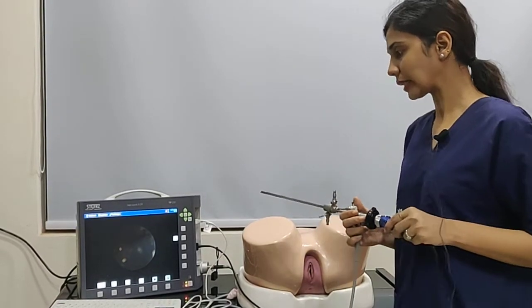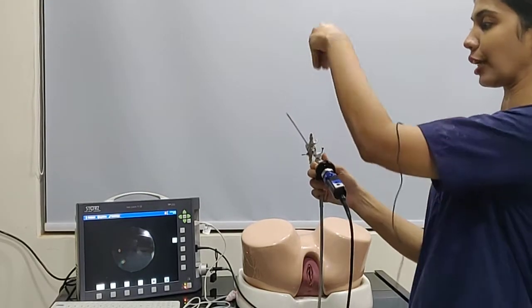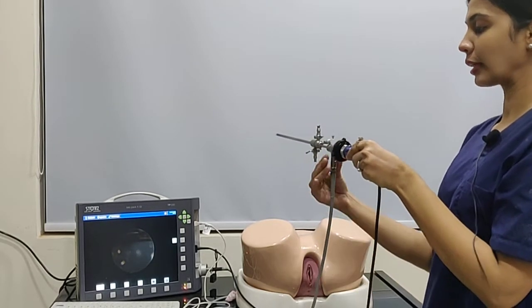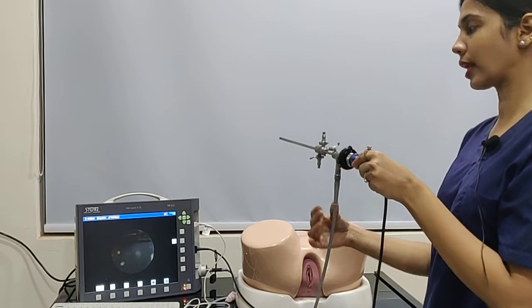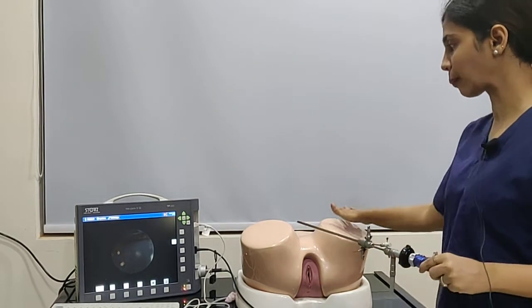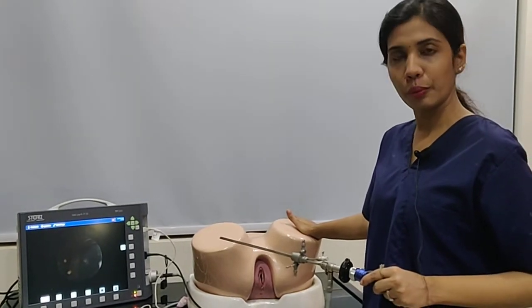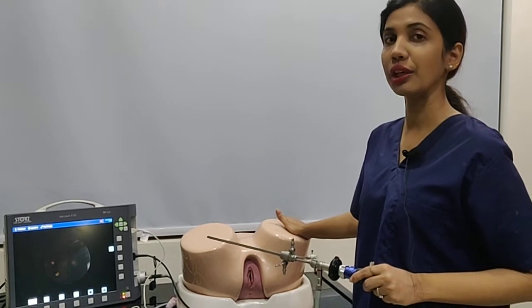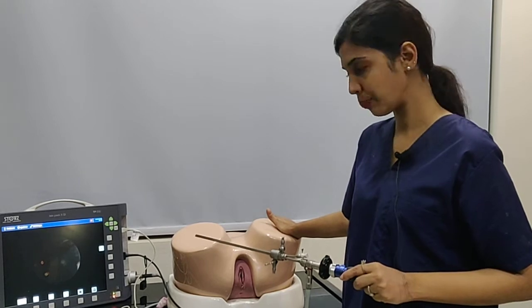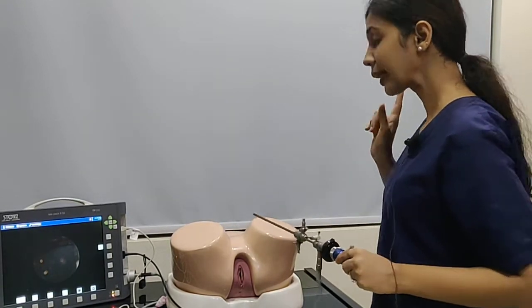Starting off, our camera head should be straight, irrigation comes in from here, aspiration from here, and the light cable is connected downwards. The patient is taken into the office area with no preparation required — not even misoprostol; sometimes maybe an NSAID may be given — and the proper position is made.